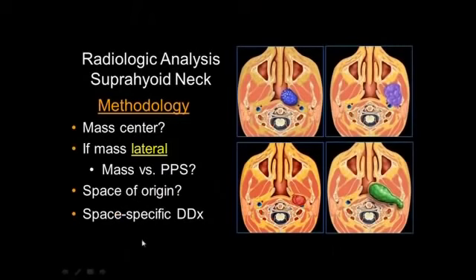So to kind of take it home, why this works as a technique is because there are different tissues normally in each of these spaces. What's on the pharyngeal surface is very different from what's in the masticator space. Got mucosa, salivary glands versus muscles and bones, and is different from parotid tissue and nodes in the parotid gland. Is different from the carotid space, which is cranial nerves, glomus bodies, and arteries and veins.